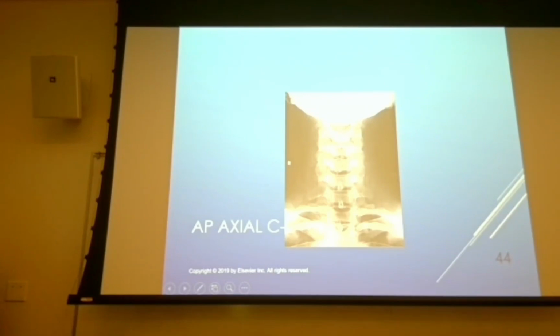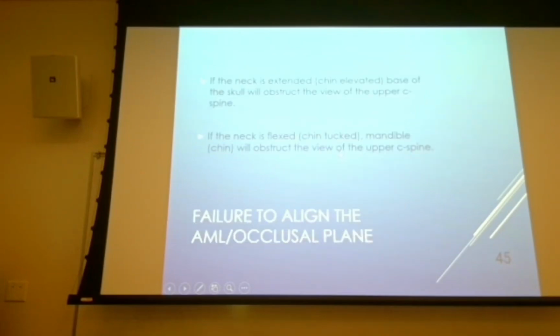So what you should see then is that right there is your spinous process, and it should be in the disc space of the vertebra directly above it, right? So open disc spaces. These little pointy things here are what we refer to as the uncinate processes. And if your angulation is too great, then they get real sharp looking. We'll take a look at that again next year in your sophomore year.